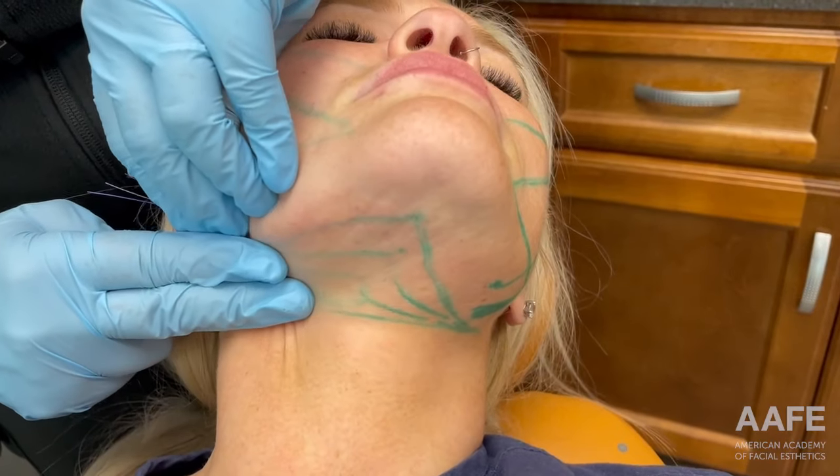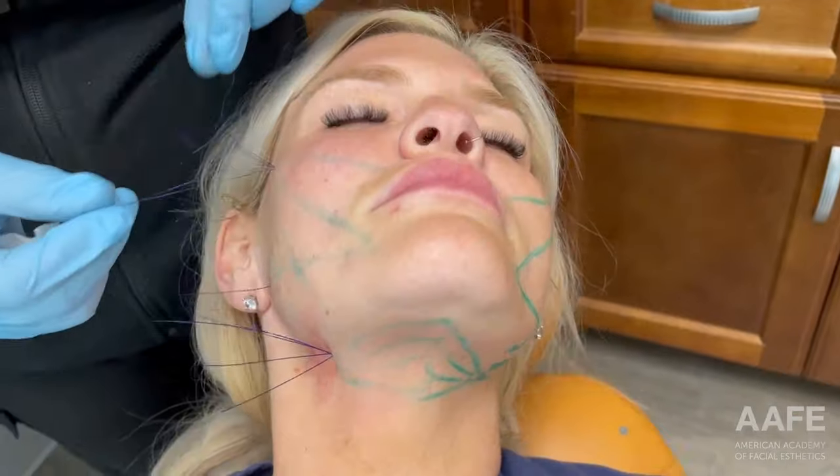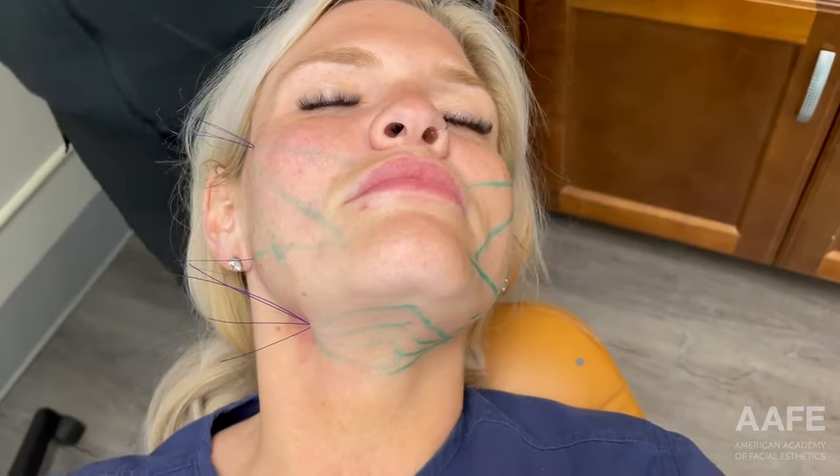Okay, so that's the neck. Between the face and neck, we have nine threads per side.